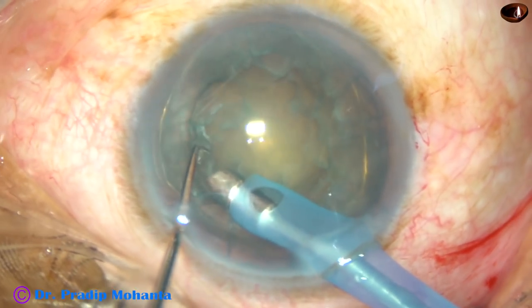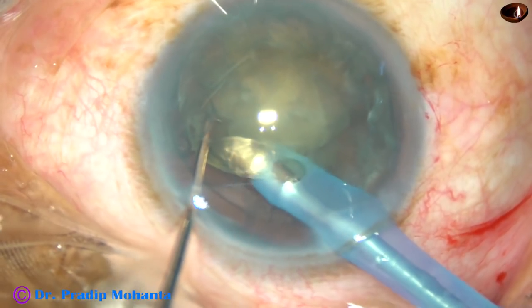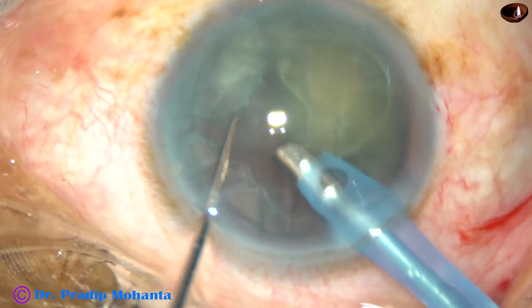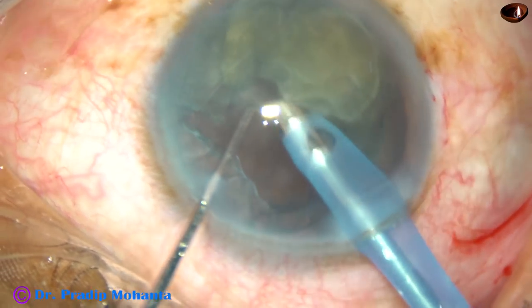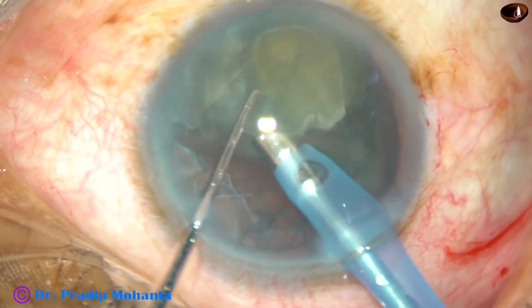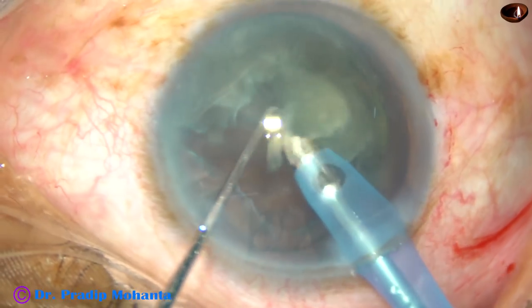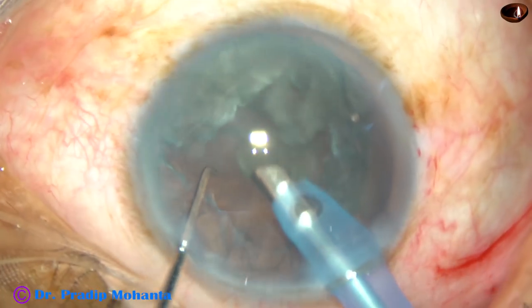Go to position 3. And see, the nucleus rotates. And as it gets emulsified, it becomes smaller and smaller in size. And that's it — the nucleus is managed.